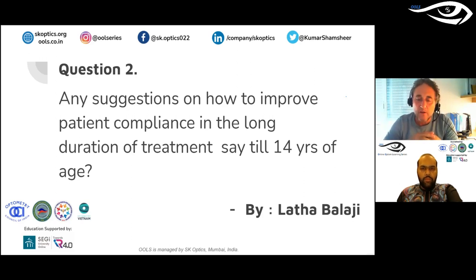In general, it's more related to comfort. So we need to treat the eye as with a GP lens. Let's see, if you have conjunctivitis on the lids, you need to treat this. If you have dryness, you need to treat it. If you have a fit that is not properly corrected and the lens is making some hassle, some pain on the lid and blinking, you need to steepen, to modify this, to change the diameter, and so on.